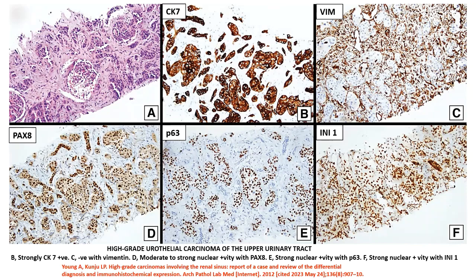However, this particular case is from a bit of an old article. Those days, GATA3 was not being utilized. So in this day and era, you will probably need to add a GATA3 to your panel to establish the final diagnosis of a high-grade urothelial carcinoma.